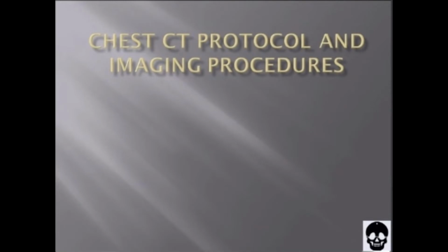CT imaging of the chest presents unique challenges because of the continuous motion of the heart and vascular structures. Improvements in temporal and spatial resolutions that have been realized as a result of multi-detector row CT have been particularly valuable in thoracic imaging. This technology allows the entire thorax to be scanned with thin sections during a single breath hold, making consistent high-resolution imaging possible.